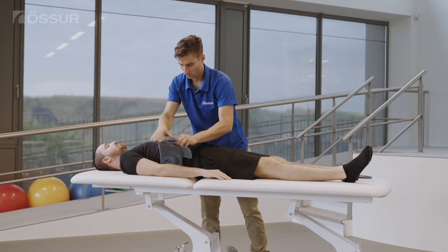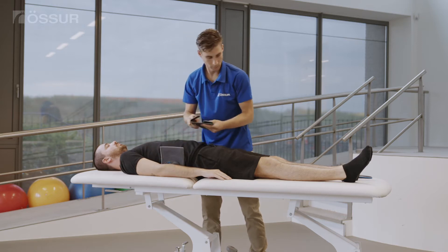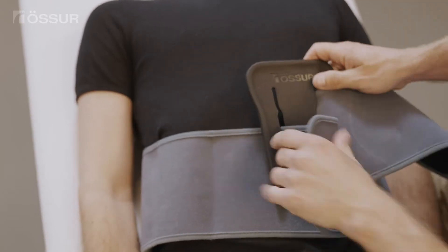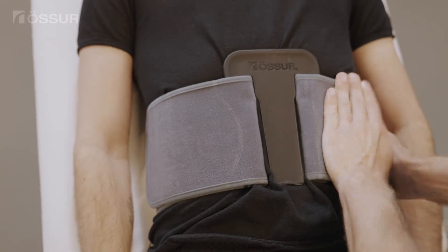Remove the overlap closures. Wrap the lumbar belt around the waist and through the fit tool. Adjust the length of belt arms to position the tool centrally and secure the belt ends to desired sizing.